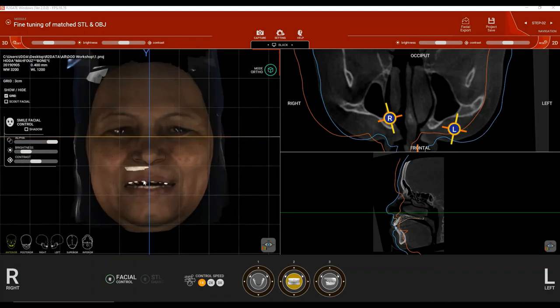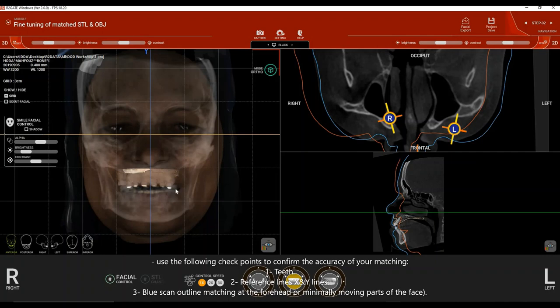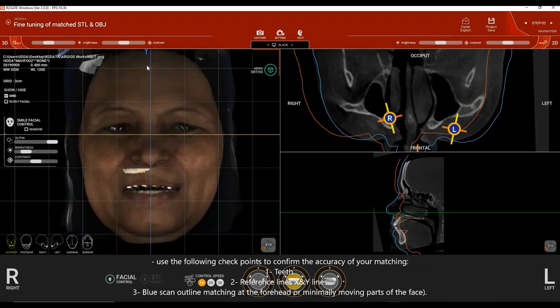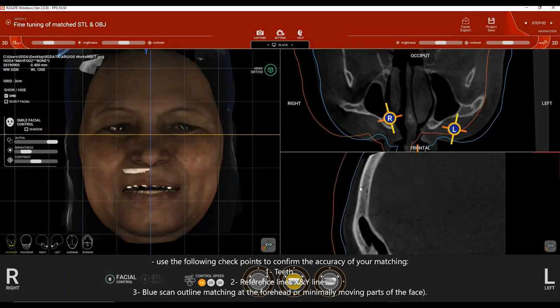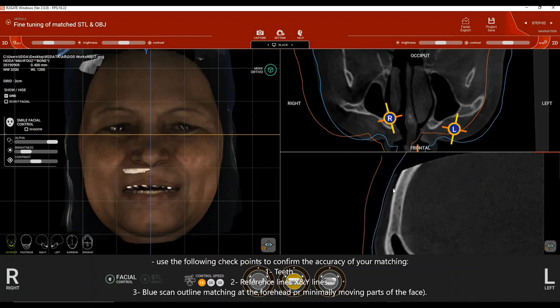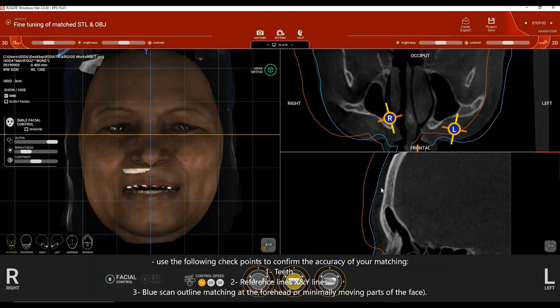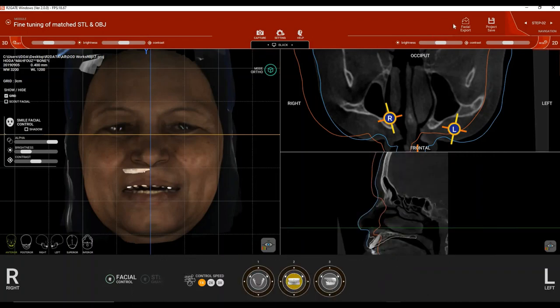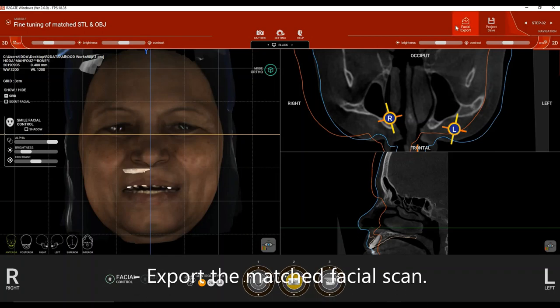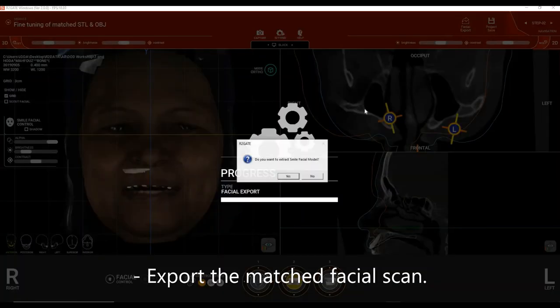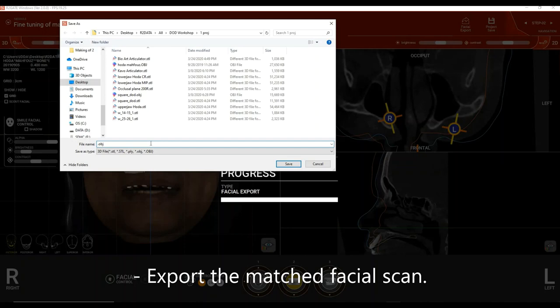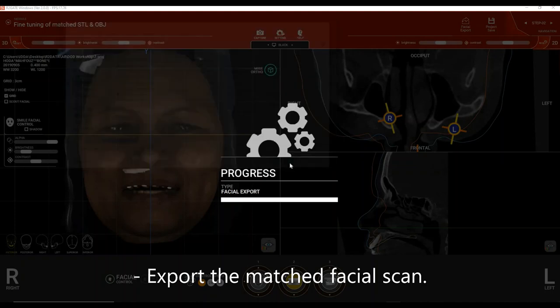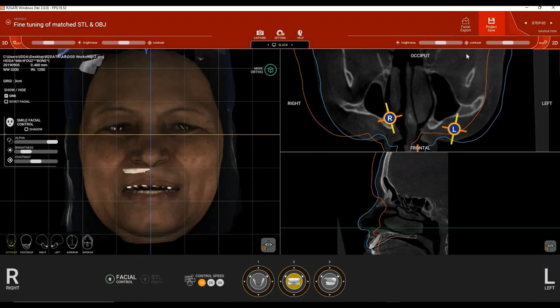To confirm matching accuracy: first, use the teeth as a reference; second, use the reference planes established during CBCT reorientation; and third, ensure the blue outline perfectly surrounds the CBCT outline and structures that don't move while the patient smiles, like the forehead. After matching is complete, export the new facial scan position by clicking 'facial export,' click Yes, name the file 'matched facial scan,' click Save, then save your project file.